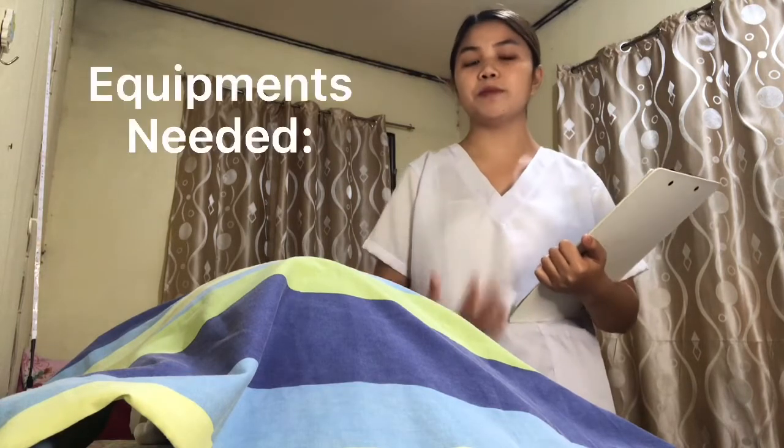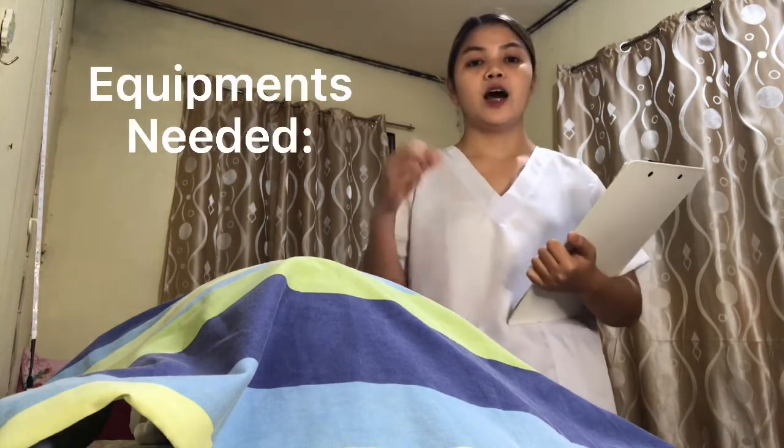Okay, so today I will be assessing Miss Gonzalez, and today we will be doing catheterization. So next, we will add to the tray the solution for cleansing the perineum and bring all the equipment to the unit. This is to save time and effort. The equipment needed are the catheter tray, urine bag, 10cc syringe, sterile water, lubricant, plaster, sterile gloves, forceps, and also the antiseptic solution.